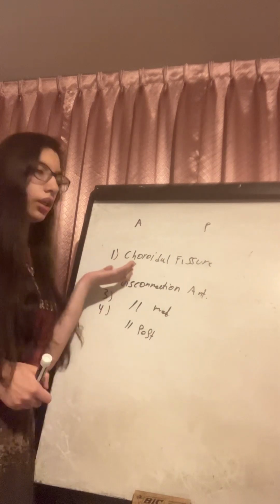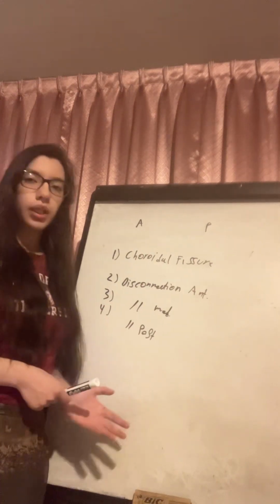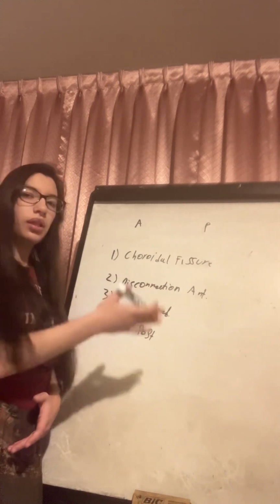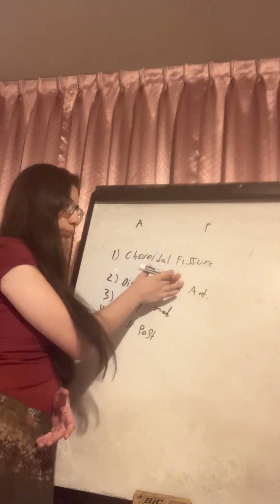How are we going to find the choroidal fissure after we incise the tinea fimbria? We look for the choroidal plexus at the temporal horn, usually medial to the temporal horn. We follow it and we find the choroidal fissure.